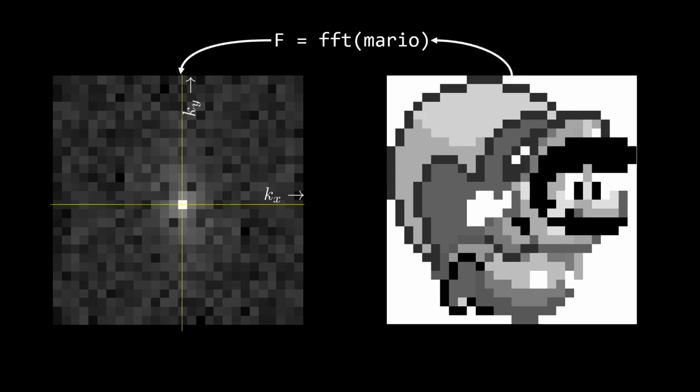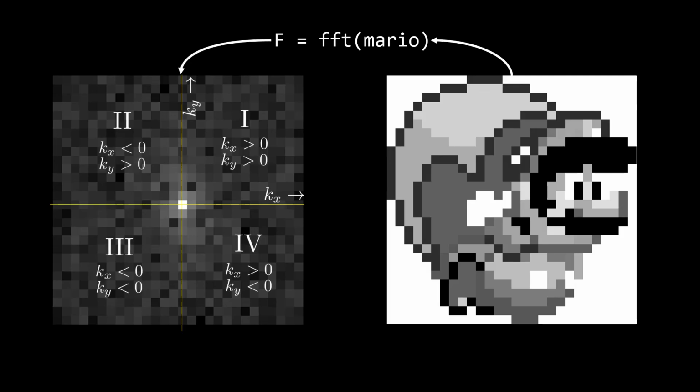And we've been illustrating kSpace on a 2D Cartesian grid with the DC offset at the center, that is, kx equals 0, ky equals 0 at the origin. Appropriately, we call this a DC-centered view of kSpace. Well, if you want to play around with the fast Fourier transform in code, just like with the 1D functions, there is a particular organization to the 2D discrete Fourier transform you'll get back. If you think of our kSpace in standard 4-quadrant layout here, 1, 2, 3, 4, the data organization you'll be given from a fast Fourier transform of an image will look like this.